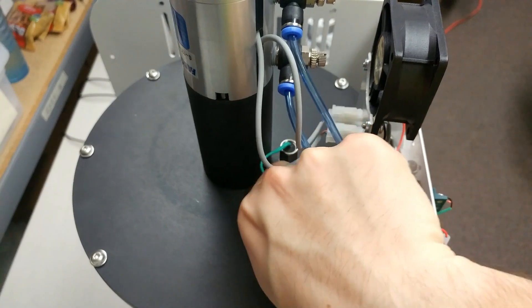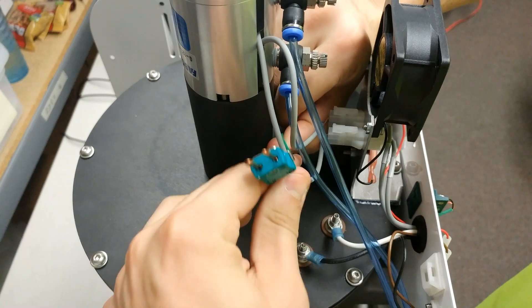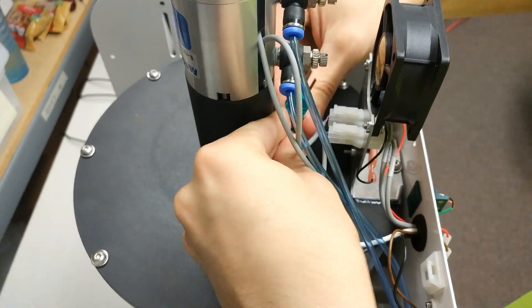To start off, you're going to want to unplug the thermocouple from the thermocouple connector. Once unplugged you can either stand the thermocouple straight up or you can scrunch it down like I'm doing in this example.